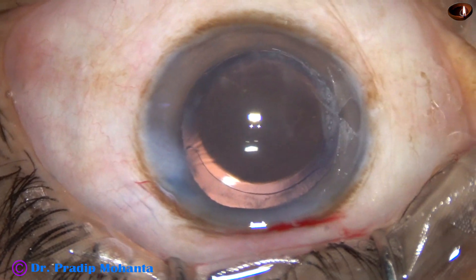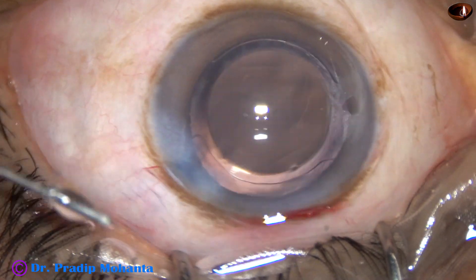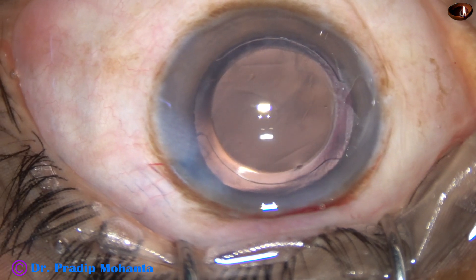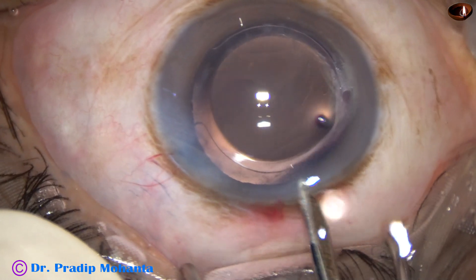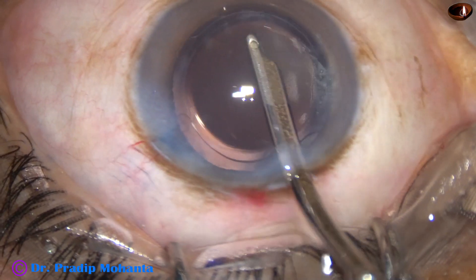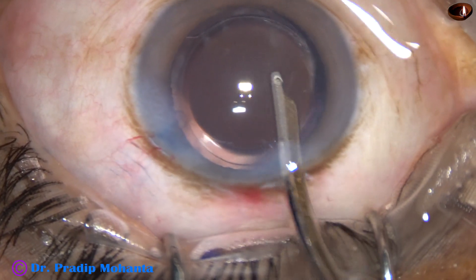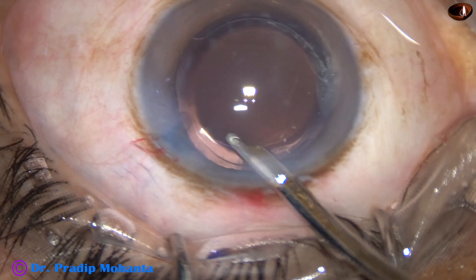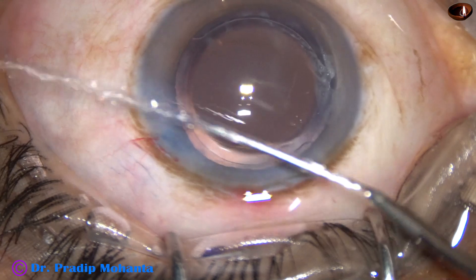The only one side port that was made in this case has been closed by hydrating the corneal stroma, and this is the final lavage of the anterior chamber. The anterior chamber is nicely formed and the case is concluded.